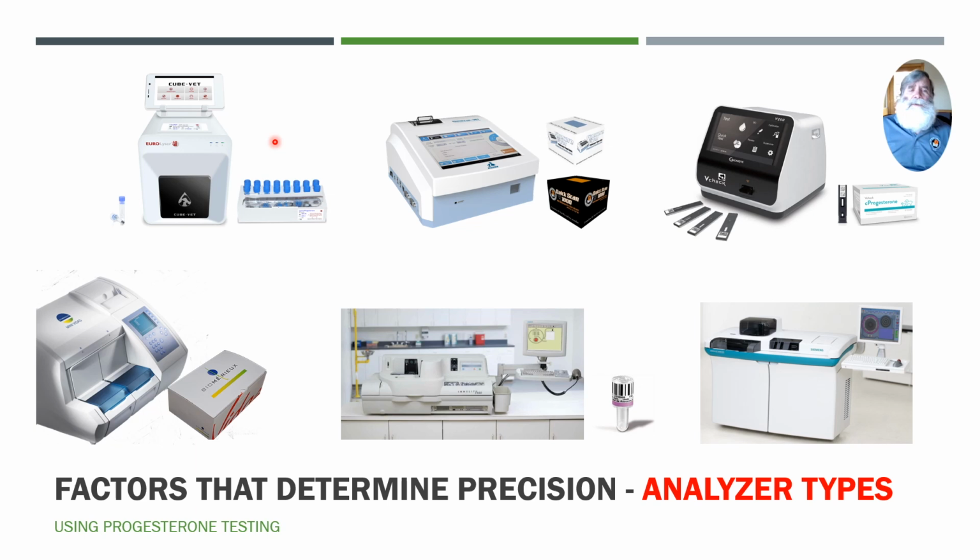When I say manual, the pipetting has to be done by the operator, the mixing has to be done by the operator, and then you put the sample in, and the instrument incubates it and then reads it. Because of the human interaction, the pipetting differences between an automatic and a manual system will tend to push the precision out. So it's a little less precise just from the fact that it's not automated and not designed at the level where it's going to cost you $125,000.